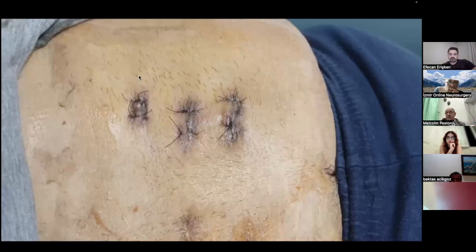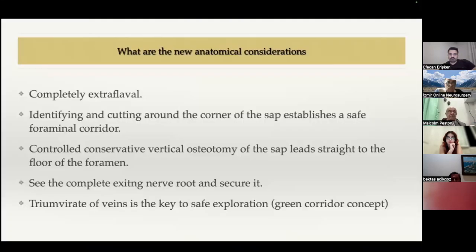Extension of fusion had to be done, so one additional scar, because I could not use that pedicle. I had fractured through that pedicle. I had to remove that lamina. I had to expose that whole root from here, and here. So obviously I had to take an extension there, but it was all done endoscopically.